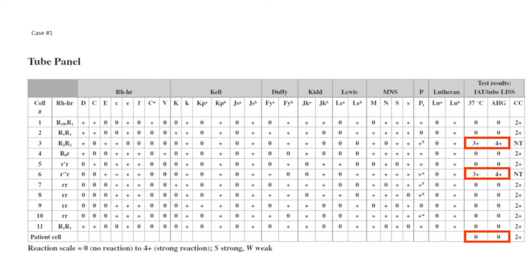By recently transfused, we mean the patient was transfused with donor red cells within the prior 3-month period. It might tell us that the patient might be having a delayed hemolytic reaction, for example. But here we see that the autocontrol is negative. So this goes along with a clinically significant warm IgG alloantibody pattern.